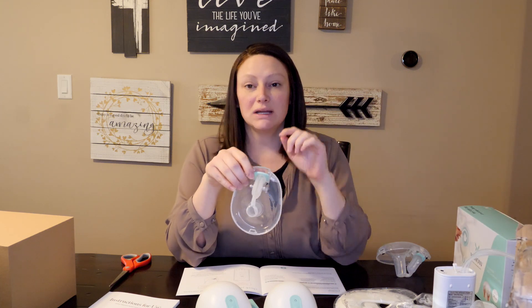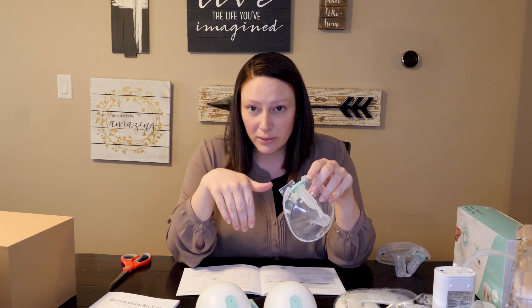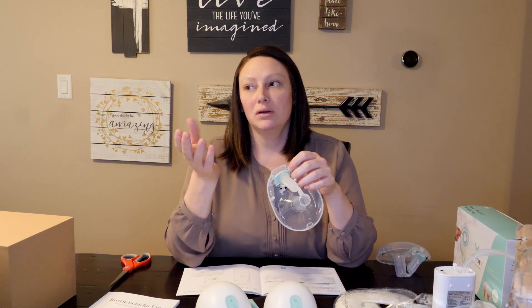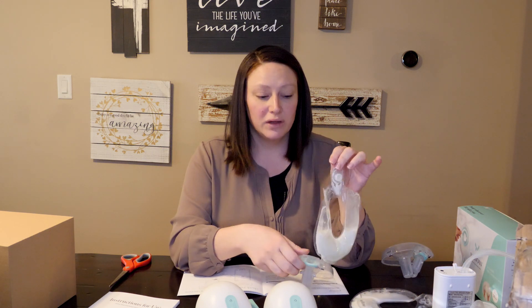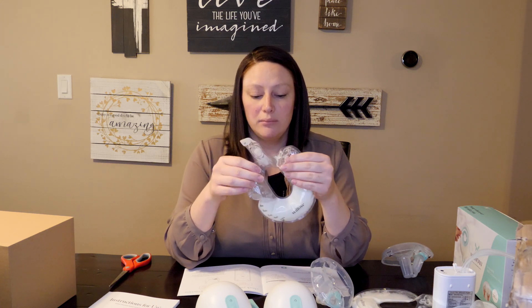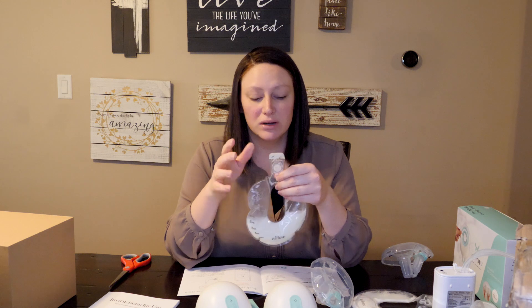I was reading in the instruction manual that with the milk containers, you can't lean all the way forward — but you can move around. If you lean all the way forward or lay all the way back, they leak. So the only completely leak-proof option is the bags. But I think the milk containers will be a reasonable option — as long as you're not bending all the way over, you'll still be able to move around and do things.